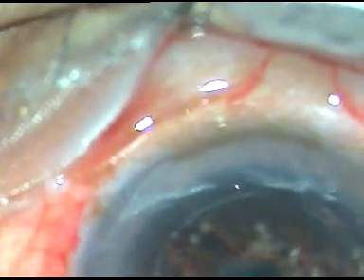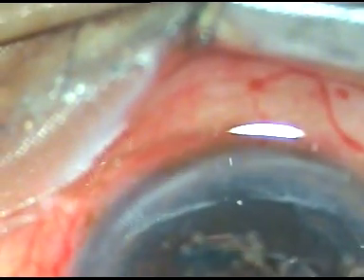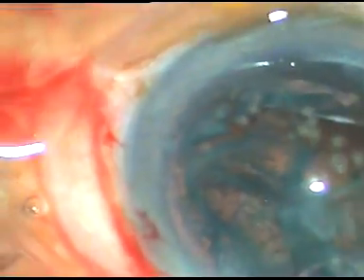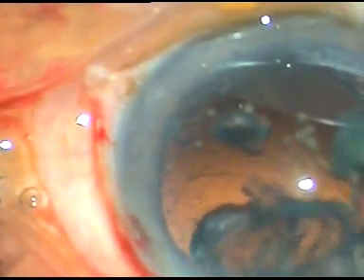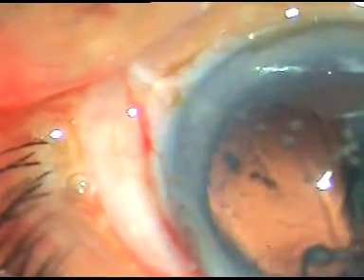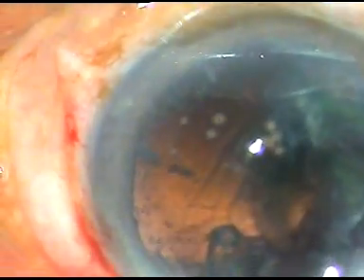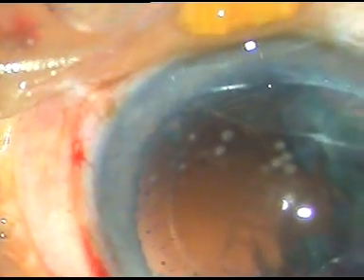Then what I did is I enlarged the incision along the limbus with a keratome and removed this nuclear piece with a fish hook that is not in the view in this video. And then epinucleus and cortex was dry aspirated, means aspiration was done without irrigation, and this caused a bit of collapse of the anterior chamber. So I injected some visco from the main incision and formed the anterior chamber.